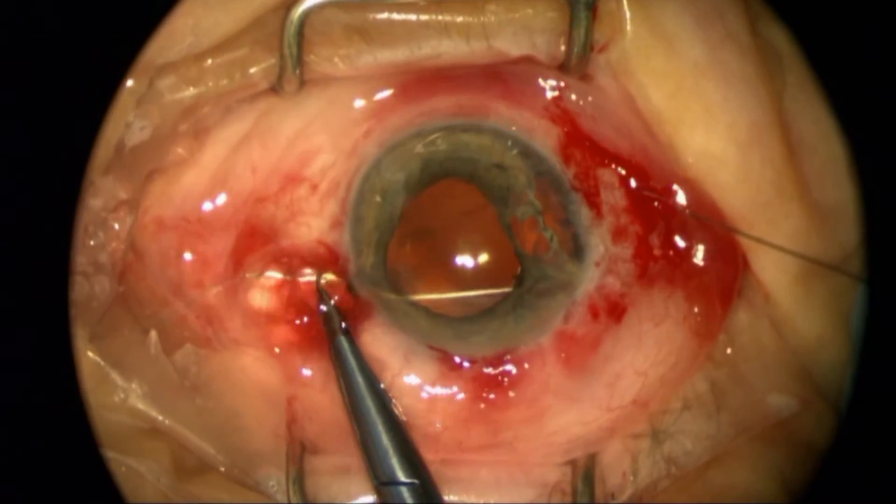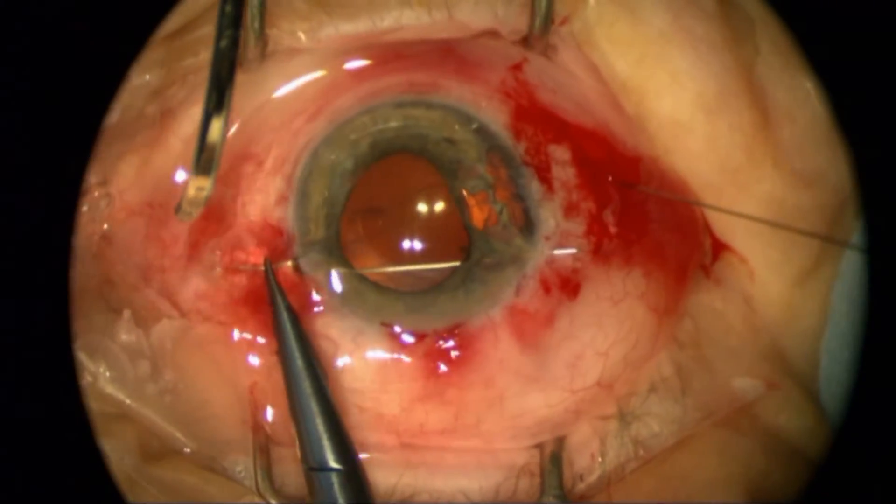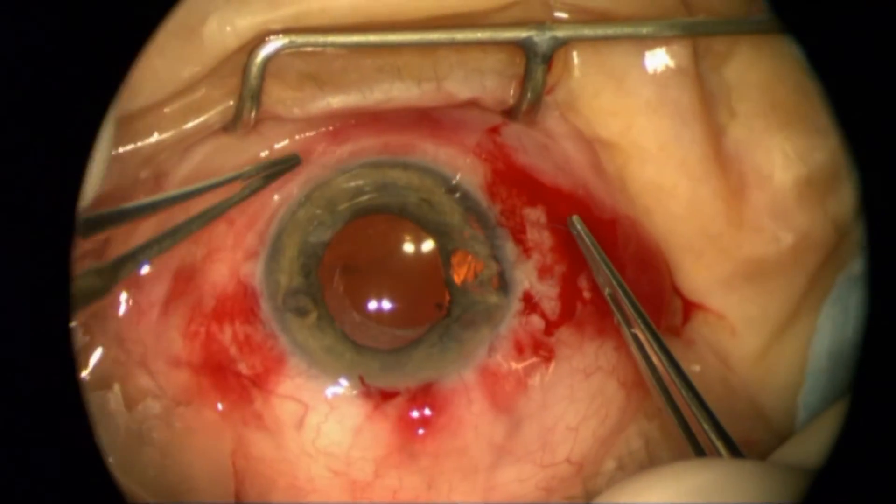The pupil is pharmacologically dilated right now, but when this patient is not dilated with a light-colored iris, the patient and family can see that the pupil is de-centered nasally.